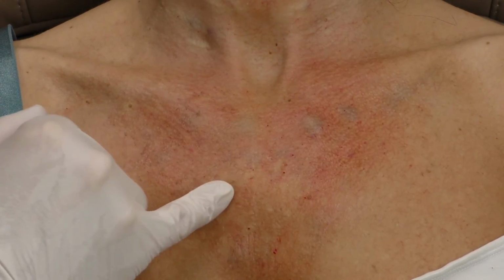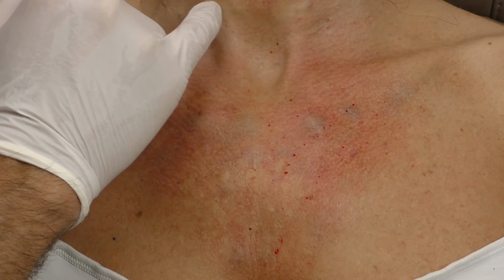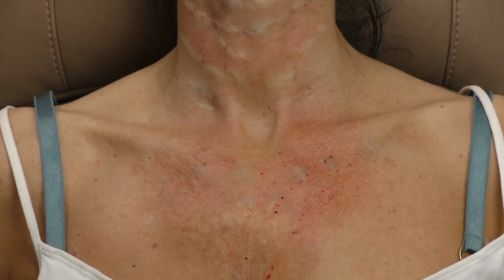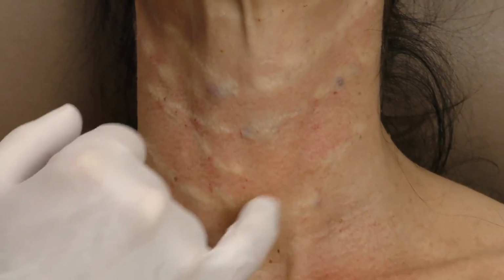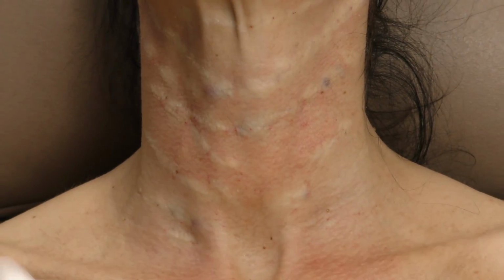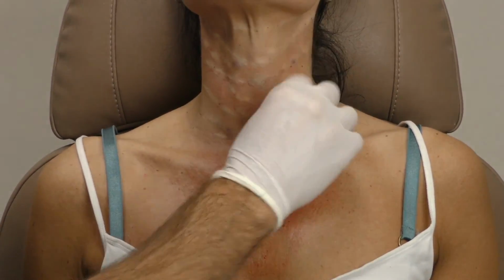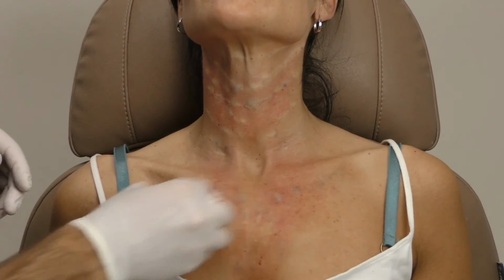After a certain amount of time, as you can see here in the previously treated neck, there's also some white discoloration. Apart from some bruising, there's a little bit of white discoloration, and that white doesn't mean that there's any vascular event, but it shows that there was adrenaline inside the lidocaine that was used for mixing through the calcium hydroxyapatite. So there's just a vasoconstriction based on adrenaline. All right, that concludes it.